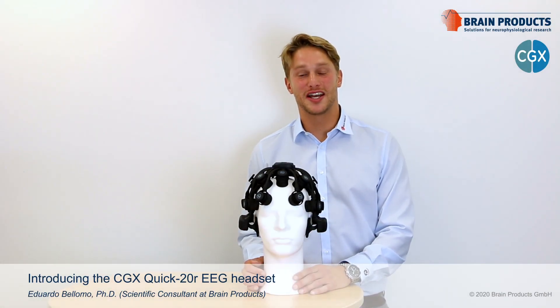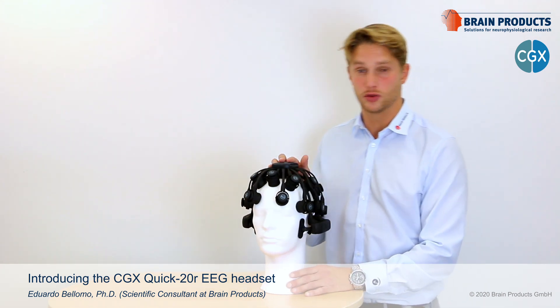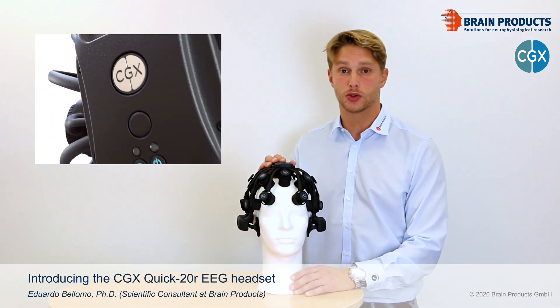Hello everyone, my name is Eduardo and I'm one of the scientific consultants here at Brain Products. With this video I'm very excited to introduce you to a new solution for high quality wireless EEG recording with dry electrodes, the CGX Quick 20R.